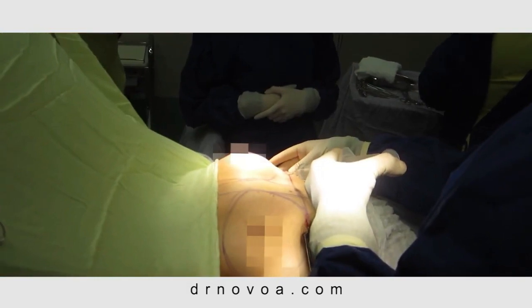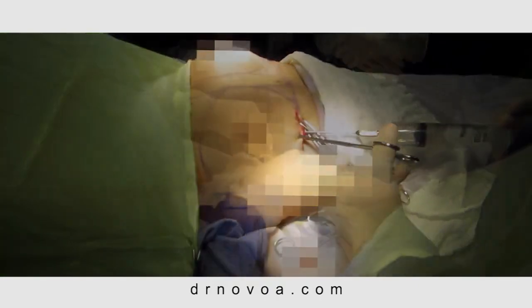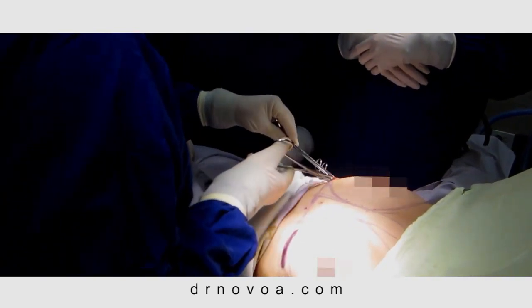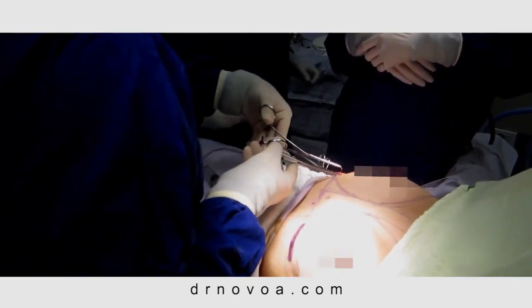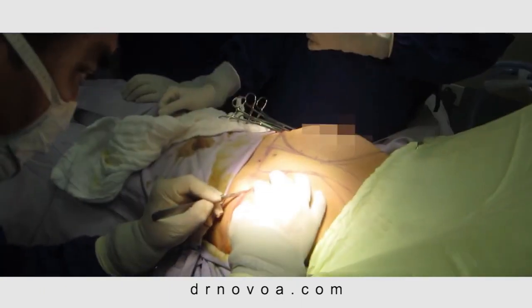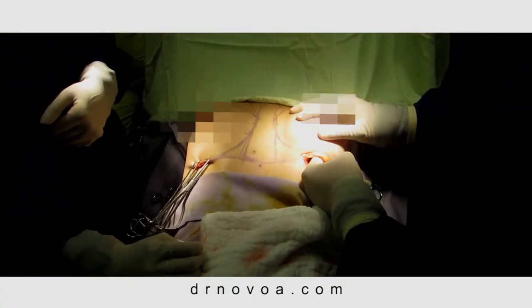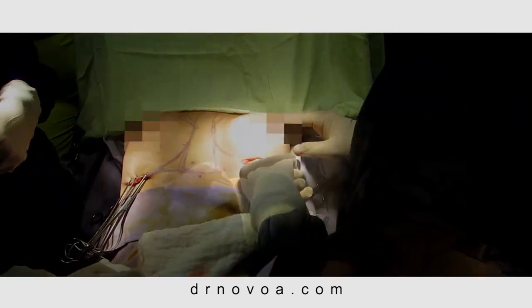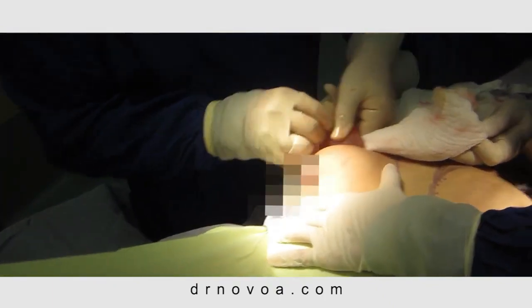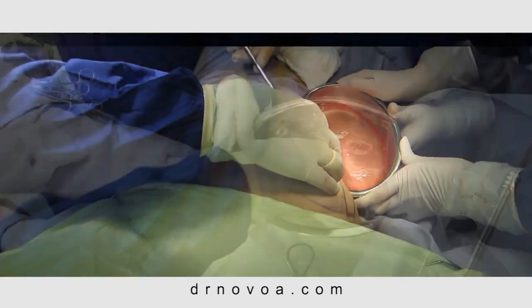An infiltration cannula is then used in the pocket and the incision is clamped. Tumescent lidocaine is then used to fill the pocket. The same steps are done on the opposite side. The implant is removed. Tumescent solution fills the second breast and the first breast is allowed to drain.